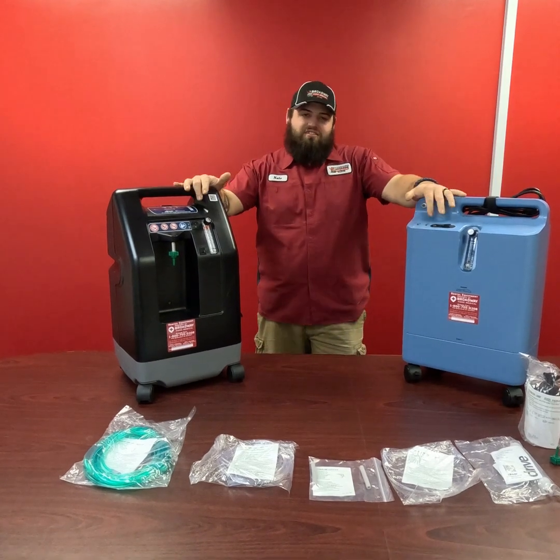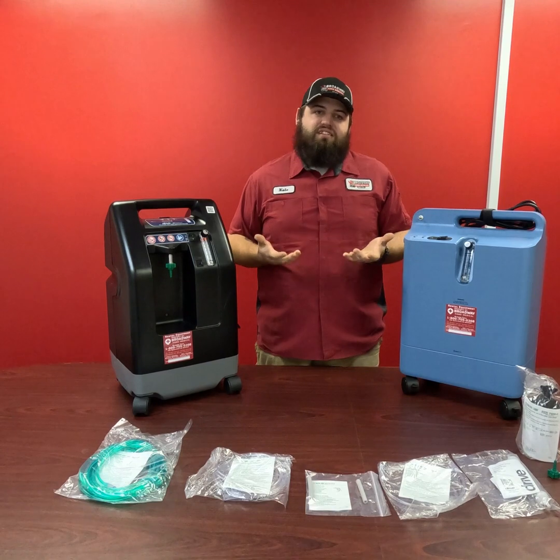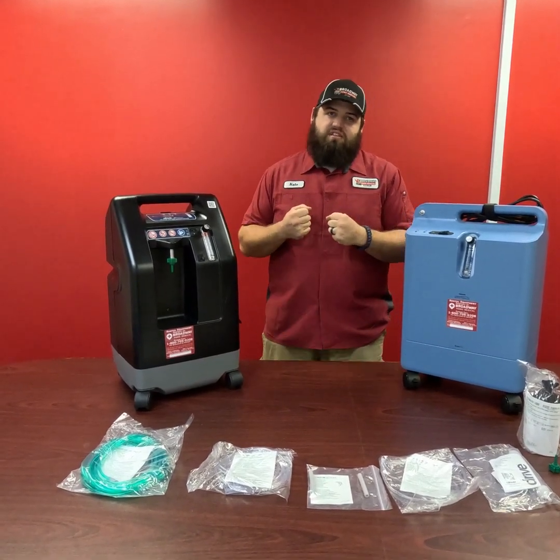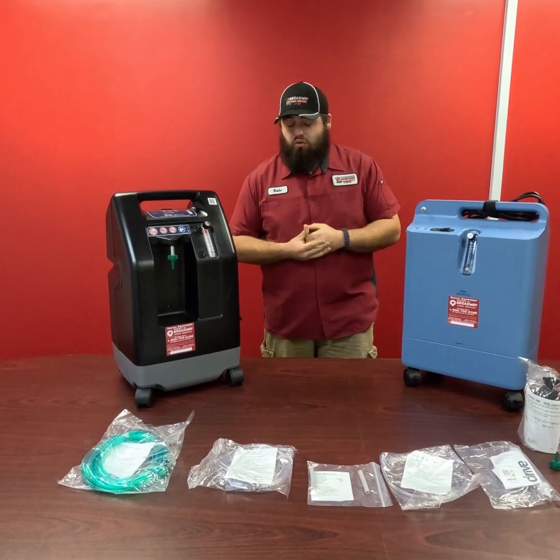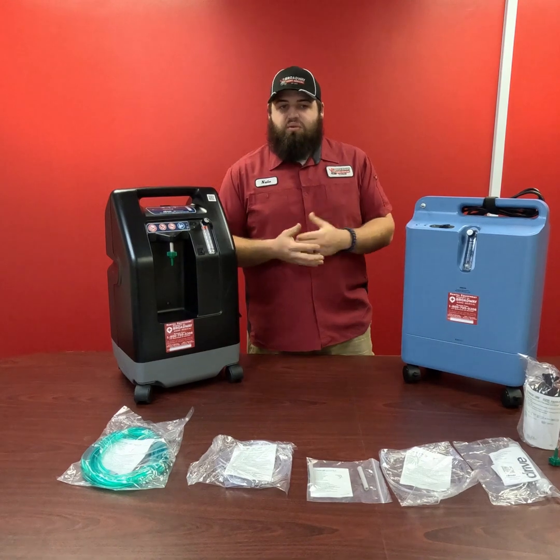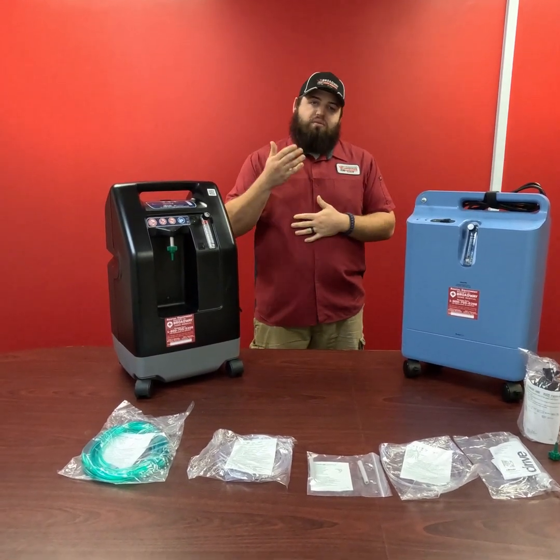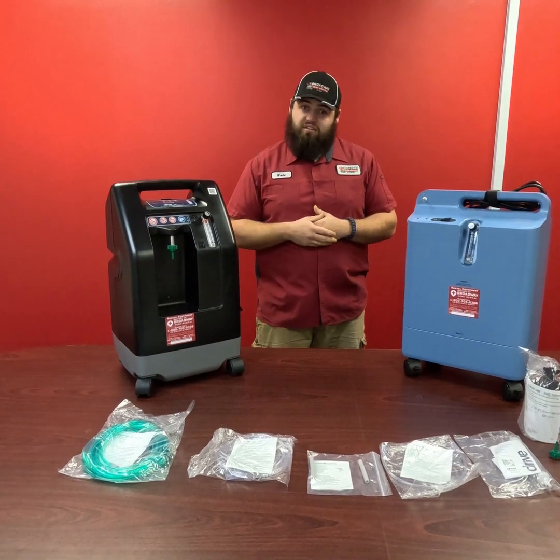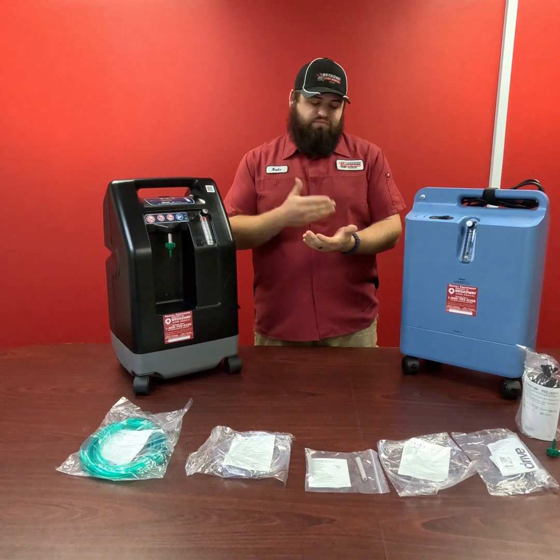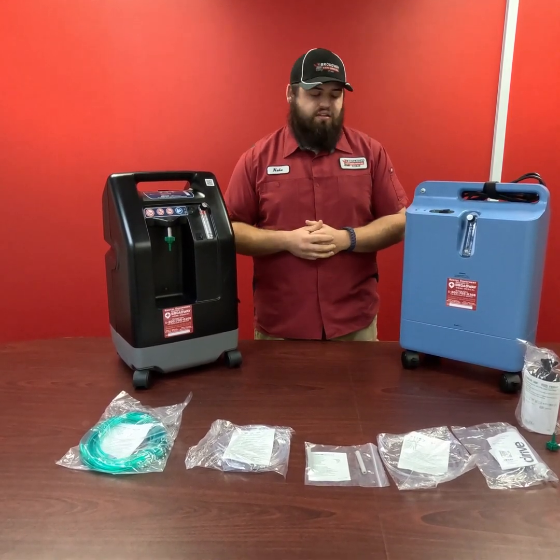So what is an oxygen concentrator? Well, an oxygen concentrator is a machine that takes the air that you and I breathe regularly and concentrates it down to pure oxygen, or nearly pure oxygen. The air that we breathe on a typical day-to-day basis here in the Midwest is around 21% oxygen. The rest is typically nitrogen, argon, and other gases.